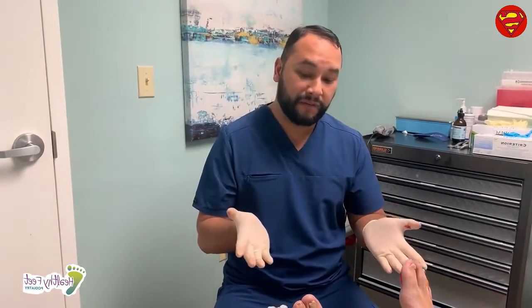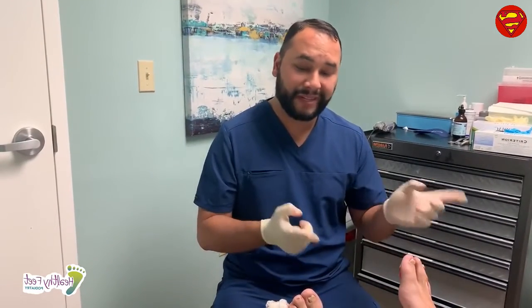So this is Dr. Cruz, bilateral 4th toenail avulsions. Pretty uneventful. We're going to send that stuff for a biopsy just to make sure, since it's been chronic over how many years? I would say several months. Several months, okay. For sure. So several months of chronic ingrowns, and therefore developing this type of granuloma, who knows.